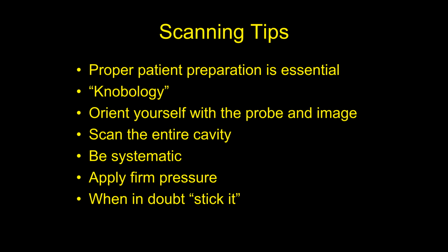Okay, knobology, that means you have to study the knobs on your machine. You have to know how to work the knobs on your machine. So when to turn the gain up, when to adjust the depth. So ultrasound is a very interactive process where you're going to have one hand on the machine punching knobs, okay, and you're going to have another hand on the probe while you're looking up here at a monitor, okay?